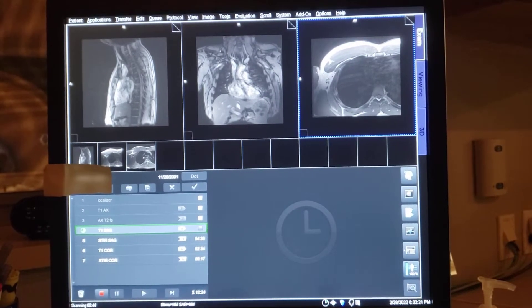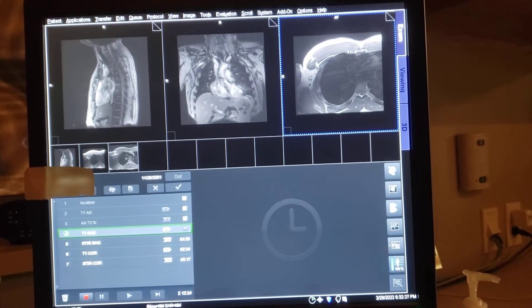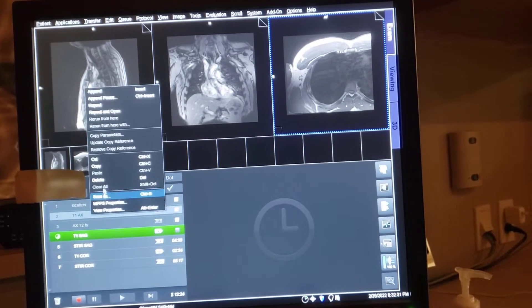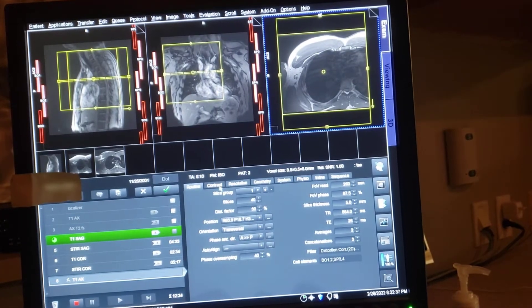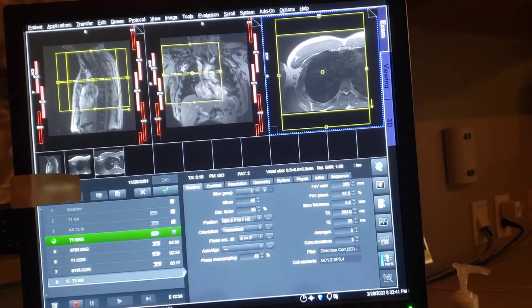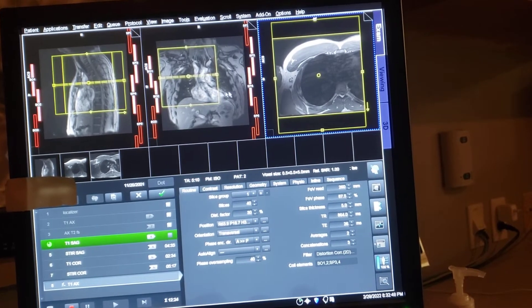Hi peeps — pectoralis. So I'm doing the right pectoralis; they have a rupture on it. This was my localizer, this is my first image here — the axial. I already see something going on, but this is my first T1 where I can see it real good. This is how I set up for it.